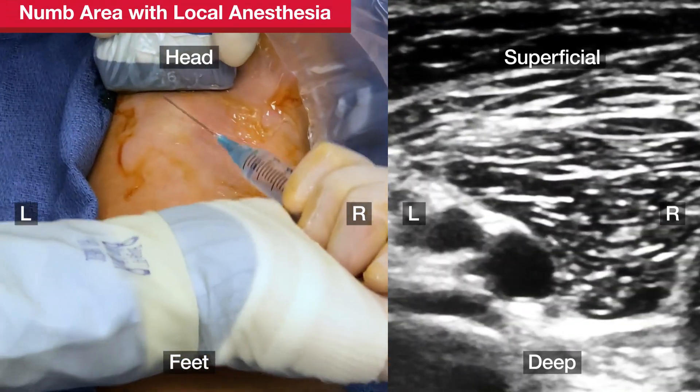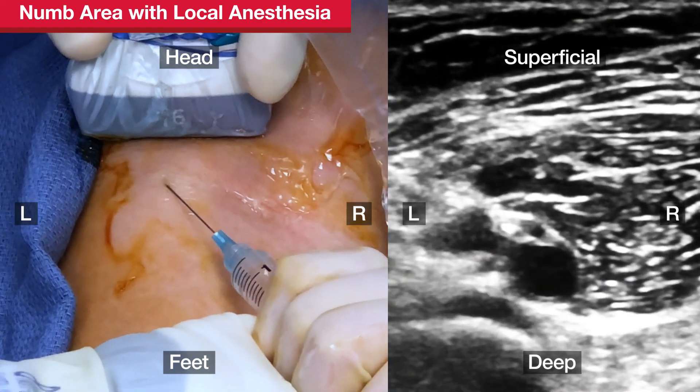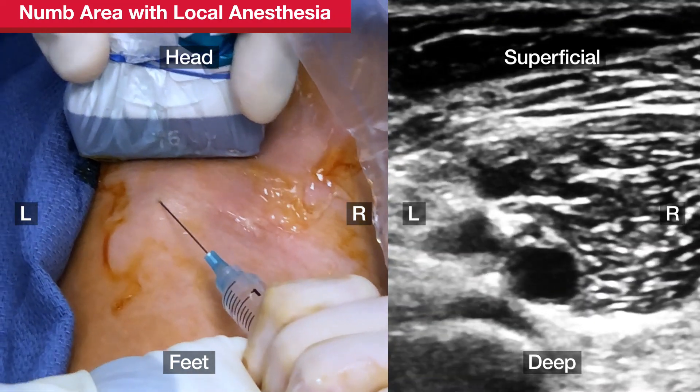After locating the vein, inject lidocaine subcutaneously. If the patient is awake, ensure that the lidocaine is injected into the deeper tissues surrounding the puncture site.